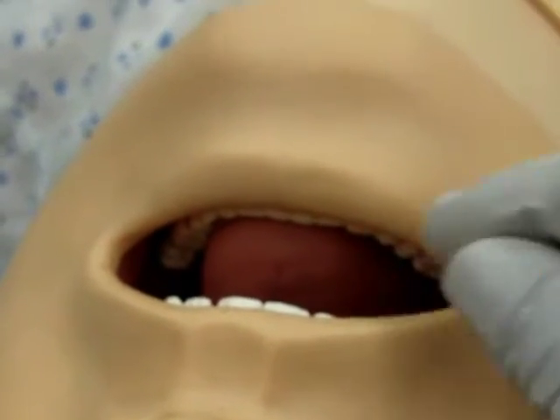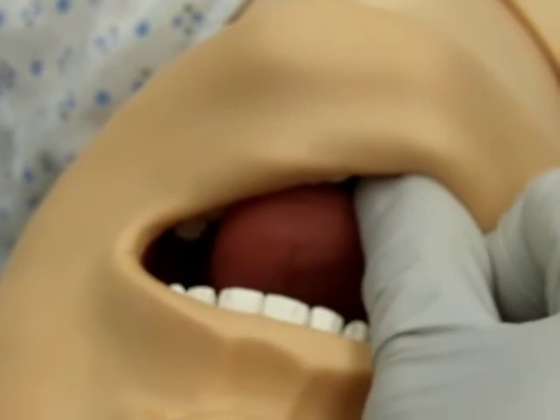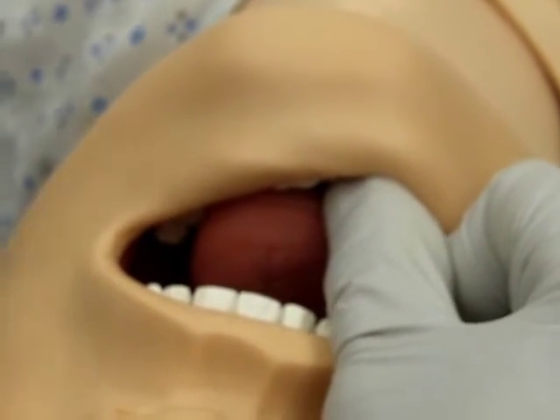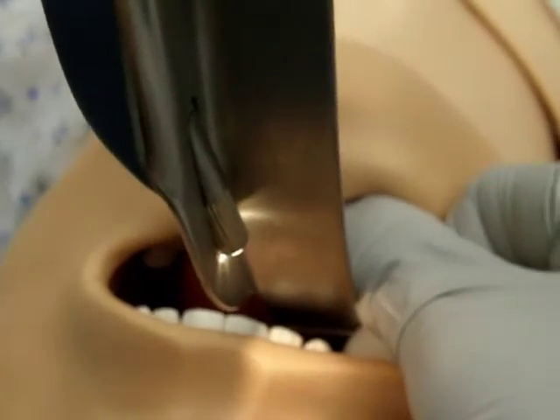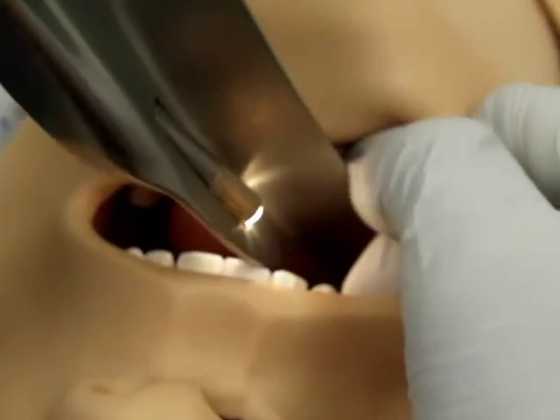Scissor the mouth widely open with the right thumb and index finger. Holding the laryngoscope blade in the left hand, insert the tip of the blade at the right corner of the mouth. Advance the blade along the lingual surface of the right mandibular molar teeth.